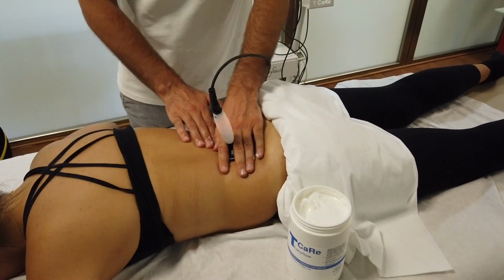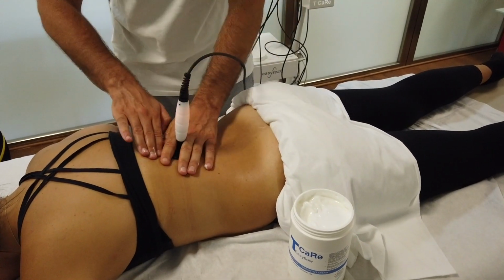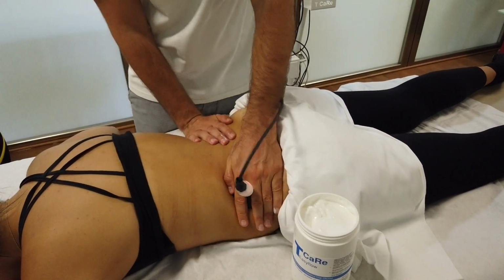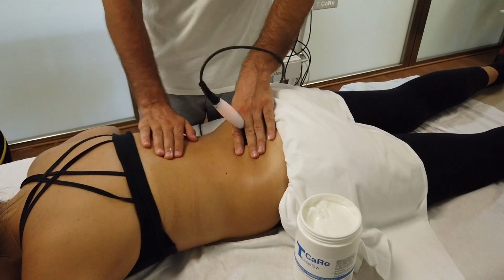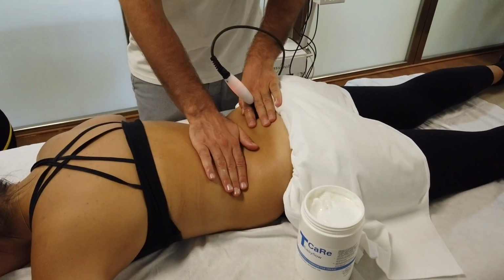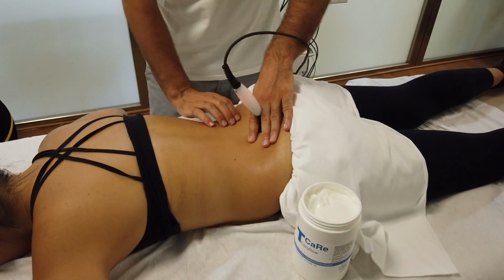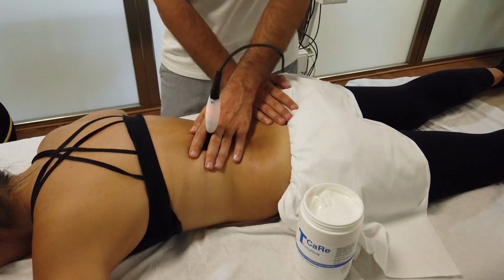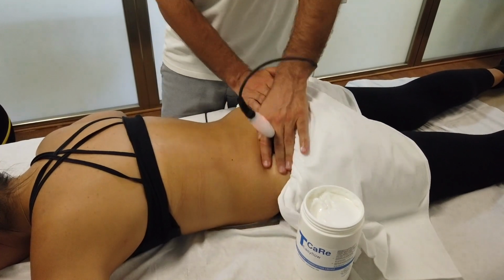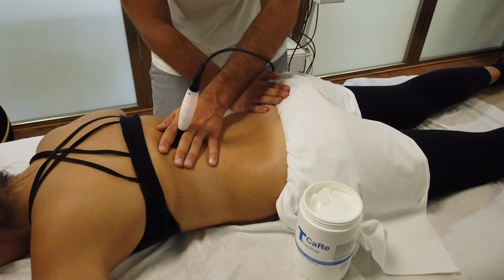In resistive treatment, I choose to treat the bone and the tissues around the bone to have a lower effect of diathermy therapy. So I treat all the bone part of the back, and I work on the bone, on the facet joint, near the sacroiliac joint, to warm up the deeper tissues.